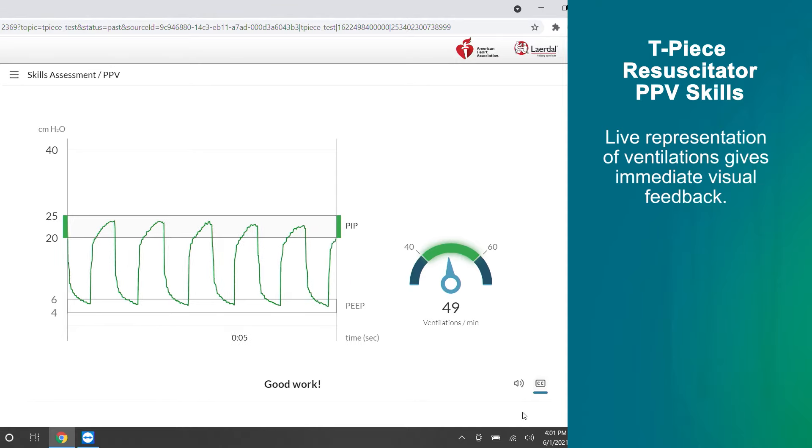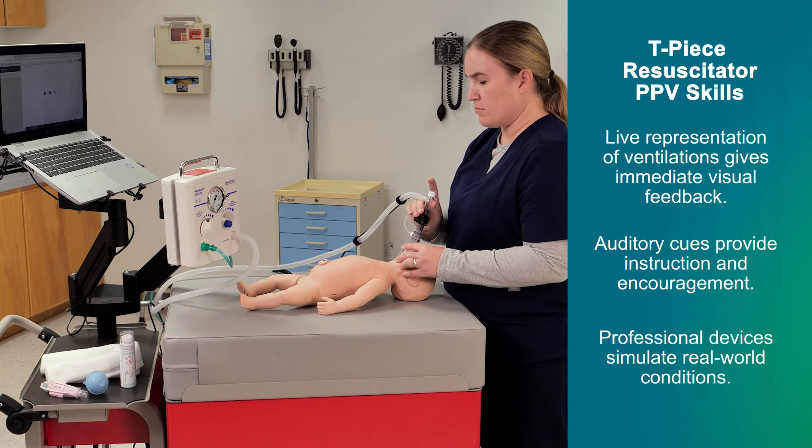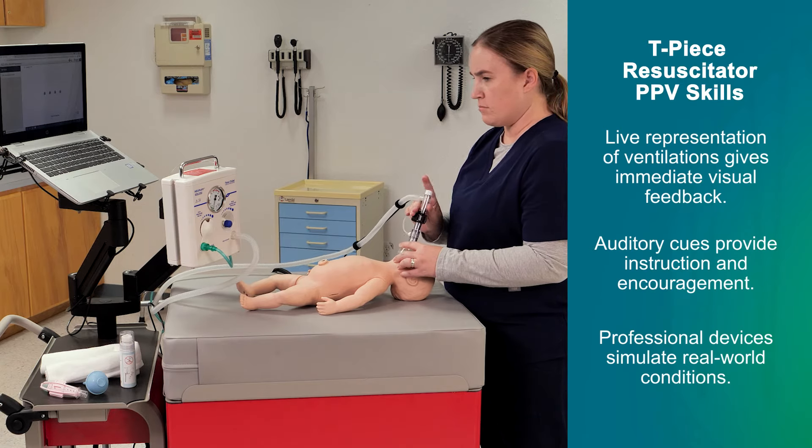Good work. Ventilate faster. Keep it up. You may stop now.